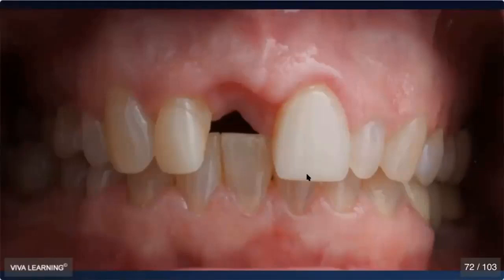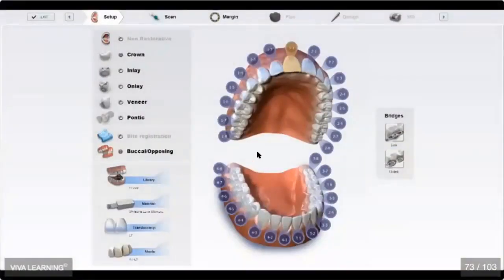So hard case all the way around to think about how do we manage soft tissue aesthetics, but also occlusion, restorative emergence. Where's the ideal position for this implant going to be in space? We could freehand it, but this would be a tough one to freehand. And this is actually one of our student cases that we did here at the university. So I think that's a testament to using this system, how powerful it can be even in the hands of people who are novice users. So let's look at a video of walking through the planning phase.